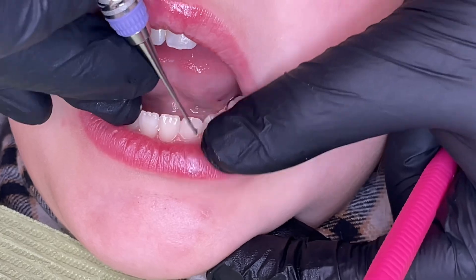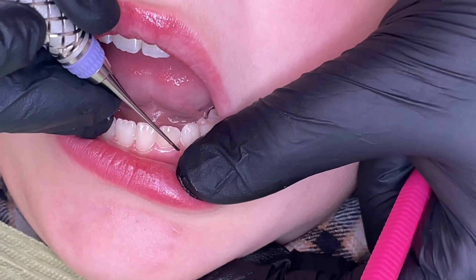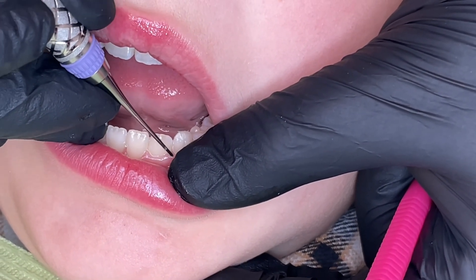It doesn't have a bend at all, so you really have to make sure you have the 70-degree angle. And since it has such a small cutting edge, you really have to roll and make sure you're adapted when you do calculus removal.